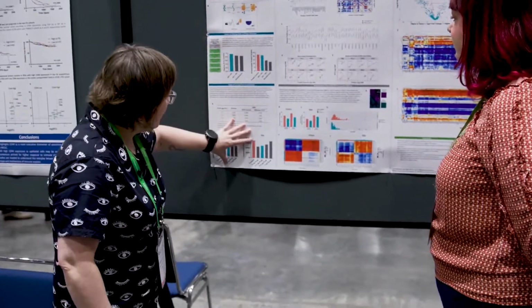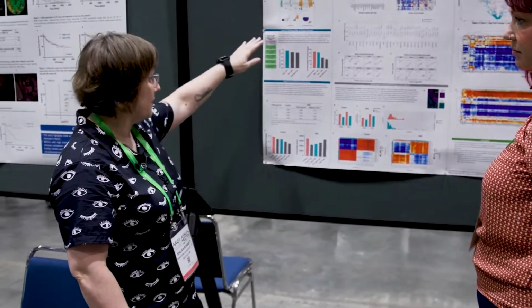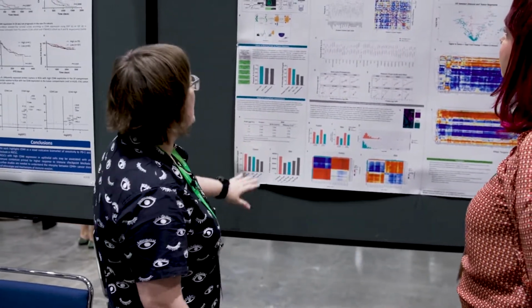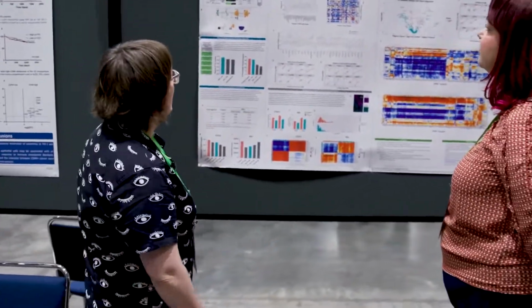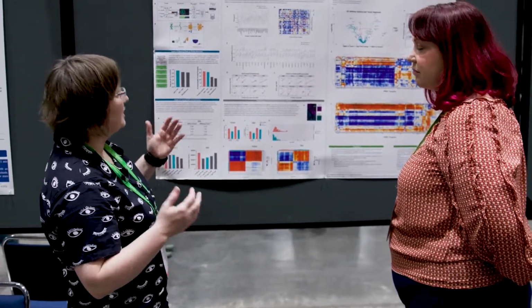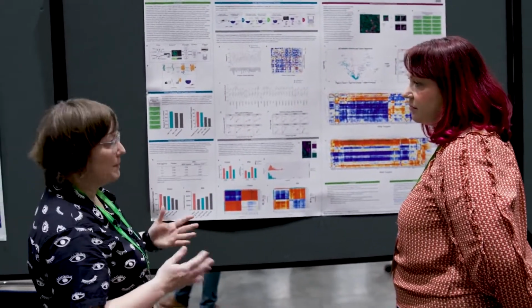Based off of all this information, and there were other things that we did look at, and we do have a white paper in which those other technical development assays are included. In the end, we came up with a simple workflow, and we tried to make it as simple as our original assays. We did have to add an extra step because you're now having to deal with two different types of probe sets. So day one, your normal dewax and epitope retrieval.